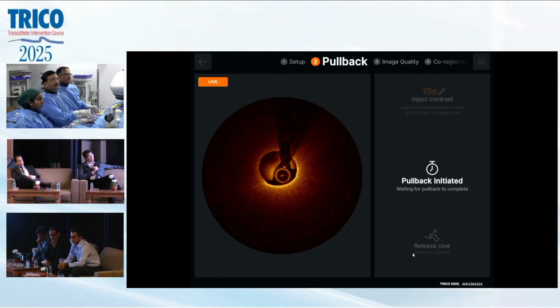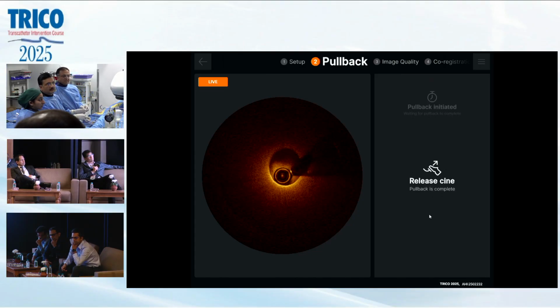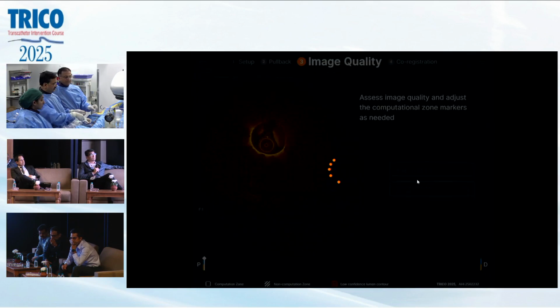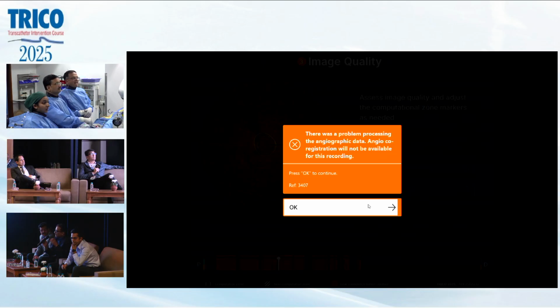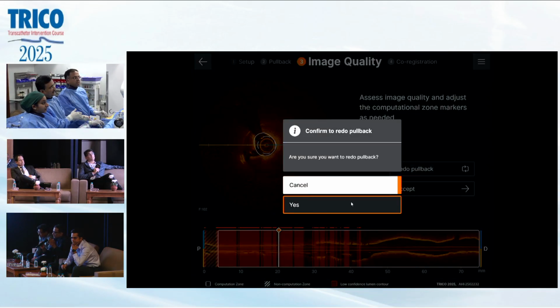Again, delayed movement. There is some delay. There would be a lot of swirling. Take one more, please. Definitely, even before putting a stent, we would have done a great deal more preparation. That is our standard practice.